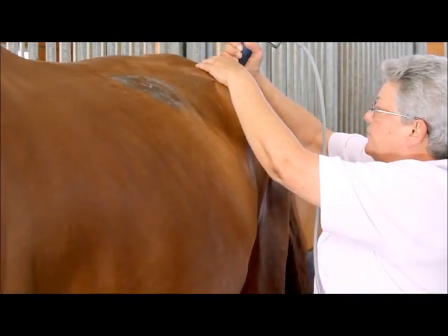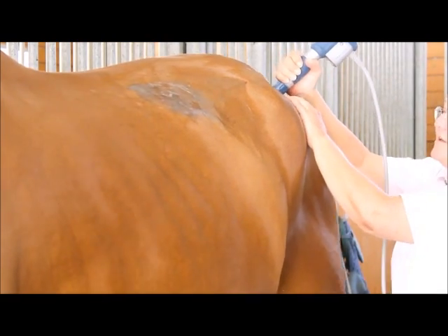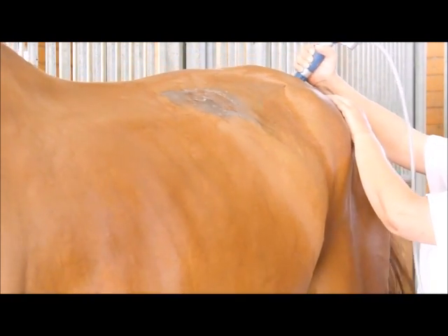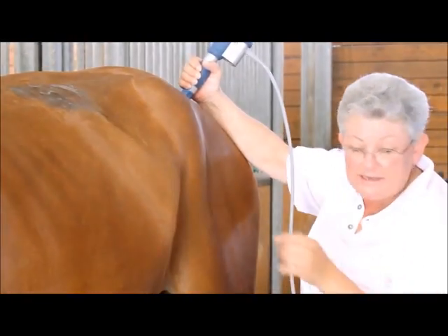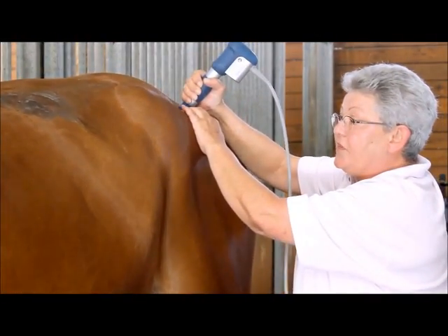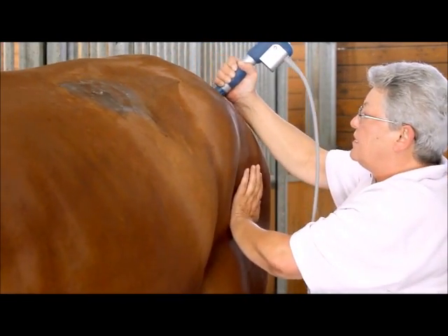Do you always use gel? Not always — it depends on what unit I have. With this one I need gel. With the other head, I can use the dry method. There is a ceramic applicator where you don't use gel.